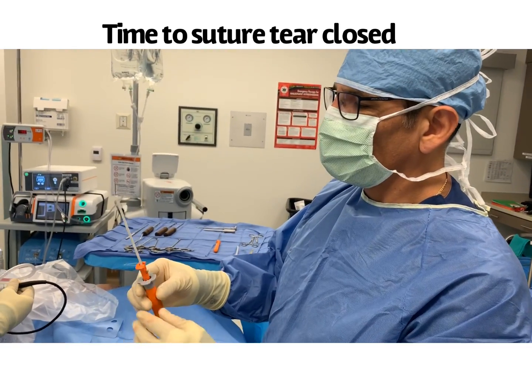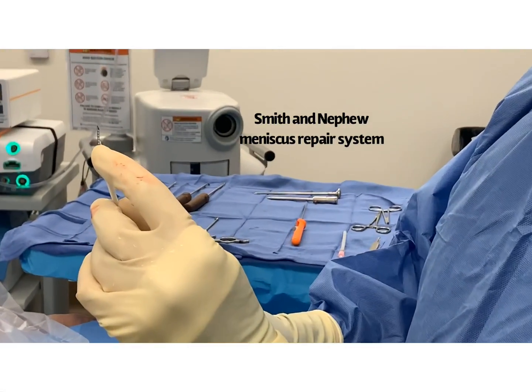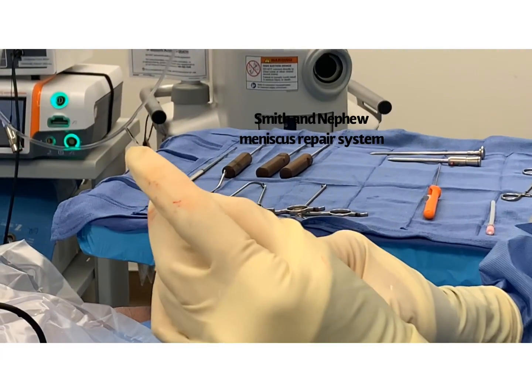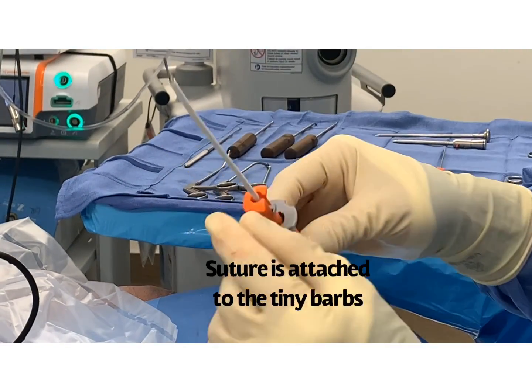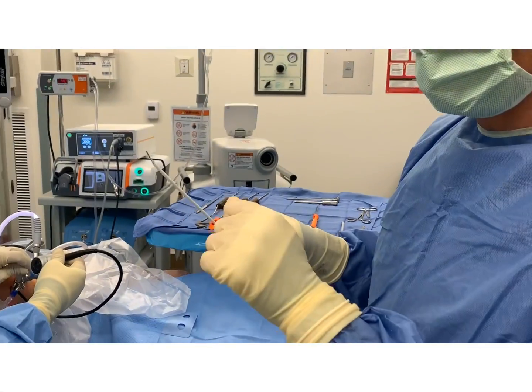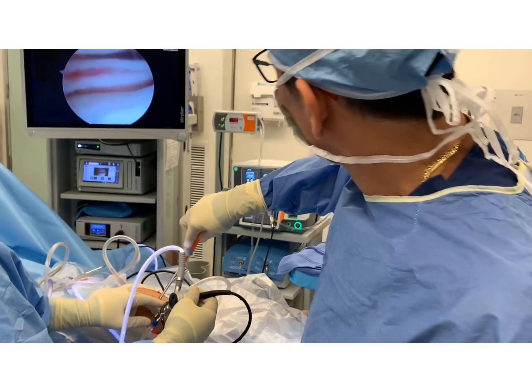I'll be using this meniscus repair system. It's basically a sewing needle — a sewing needle that throws two barbs. So you penetrate, remove, penetrate, remove. The barbs get soft tissue and then I pull the self-cinching knot.